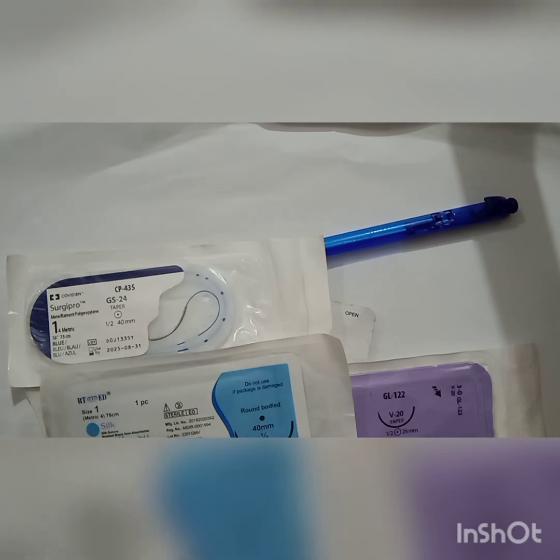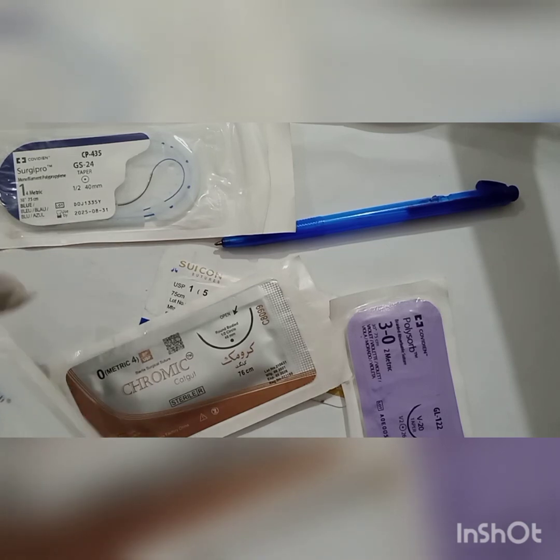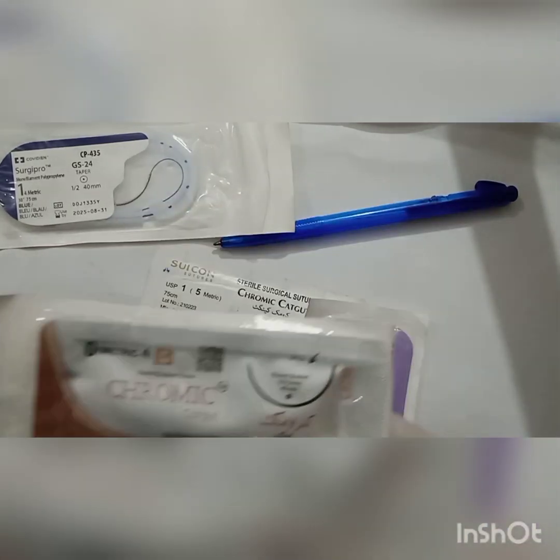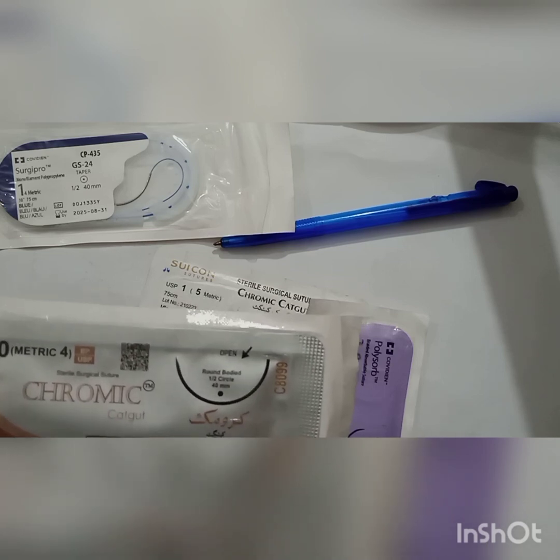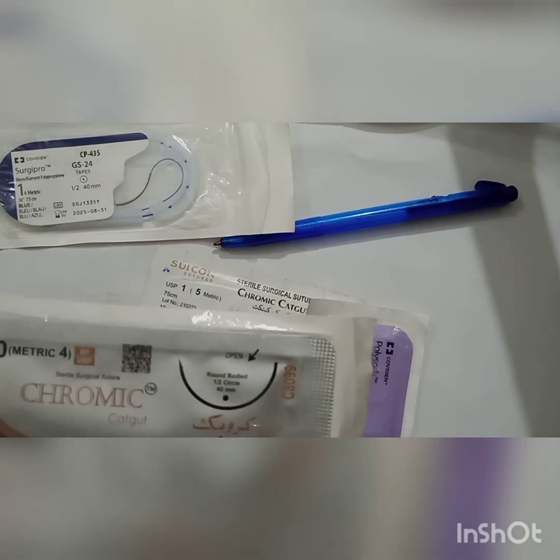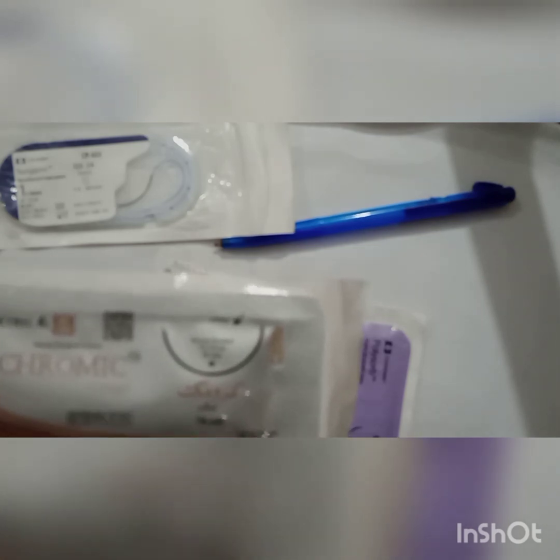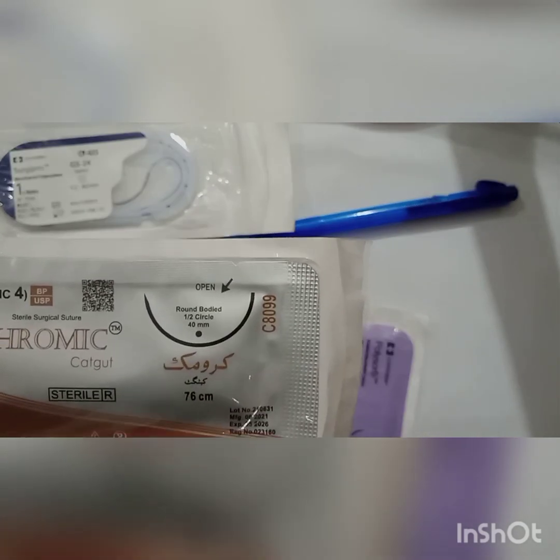Some sutures are absorbable, like vicryl and catgut, and others are non-absorbable, like silk and polypropylene. Further, they are divided into whether they are synthetic or natural, like chromic catgut. Catgut is a natural material taken from the submucosa of animals. The cat may be a misnomer, because it is not always taken from the gut of the cat, but from sheep and other animals also, from the submucosa of the intestine of different animals.